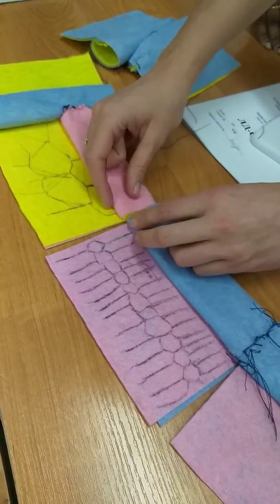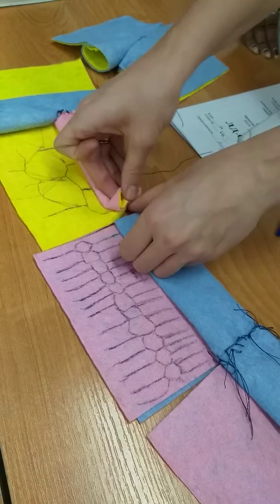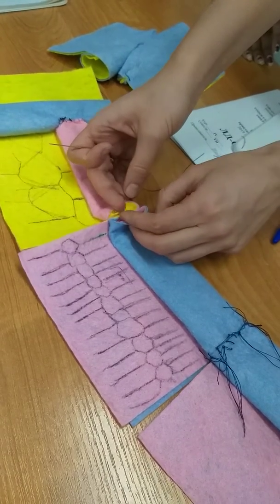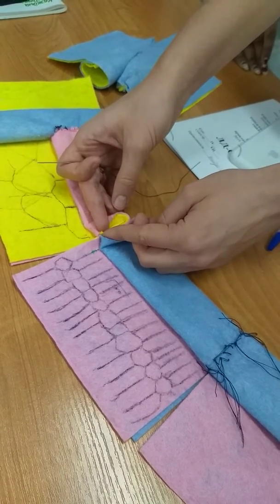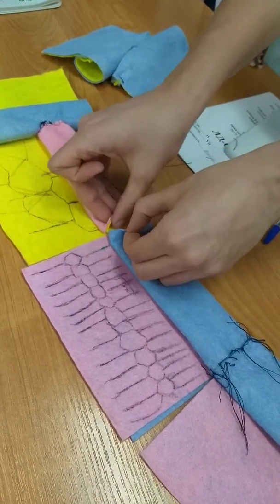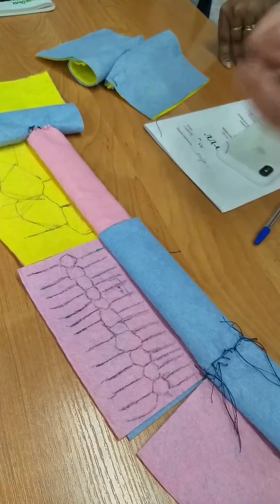So you start making the anastomosis. You have the hold suture here and hold suture here. This is the posterior wall of the anastomosis. You start making the lower layer of the suturing, and after that the superficial layer, and after that the inner layer. And here you make it vice versa. You start making the inner layer, and after that the superficial layer.